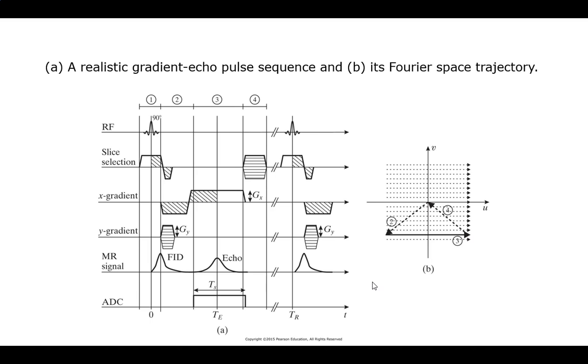All right. So here's another one of these lovely little trajectories. They're including on here something we didn't include on the last one, which is cleanup after. I remember we just kind of ended. So we're going back to a simpler sequence, no flipping here. We do one motion over.